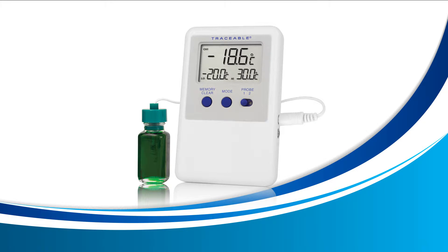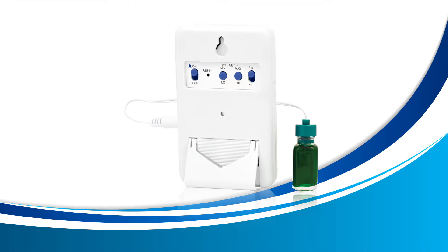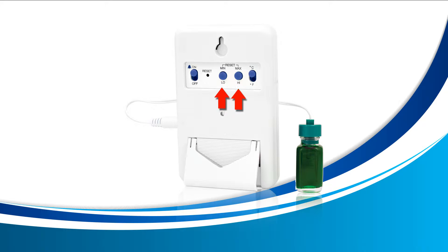Setting your high and low alarms. In this lesson we're going to use the mode button on the front of your device to enter alarm display mode. Then we're also going to use the low and high buttons located on the back of your device to set the low and high alarms.